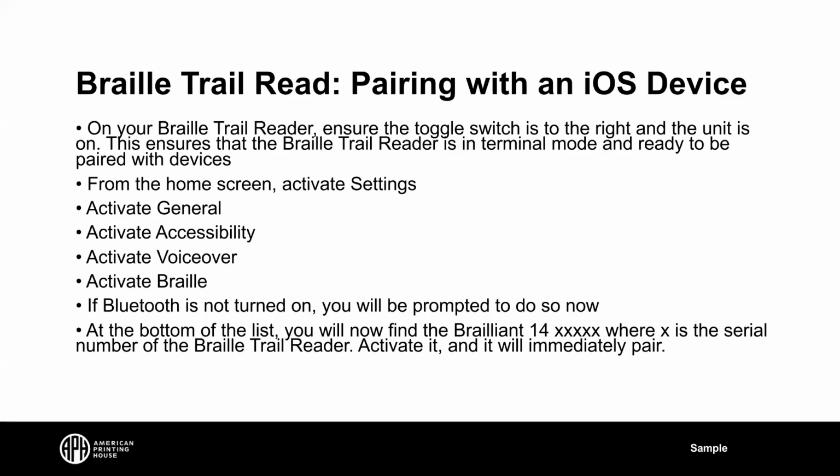If you feel readable words, it is definitely not turned off. And if you feel no sponginess, you might just be in a totally blank area, and your device might not be turned off. But if you feel slightly raised Braille cells, maybe about 10% of their normal raising, which is beyond millionths of millimeters or something, that would indicate that the Braille display is turned off.